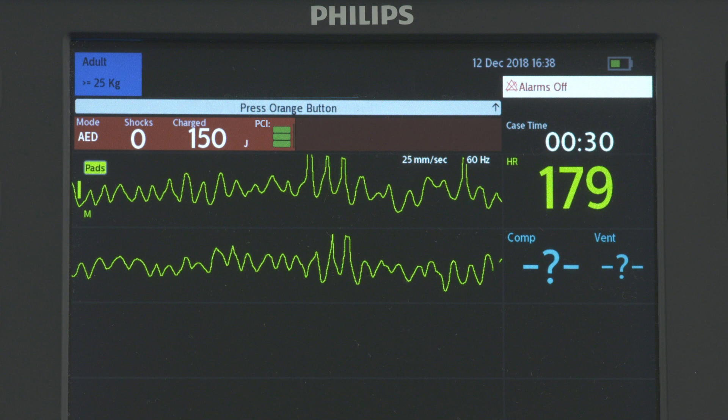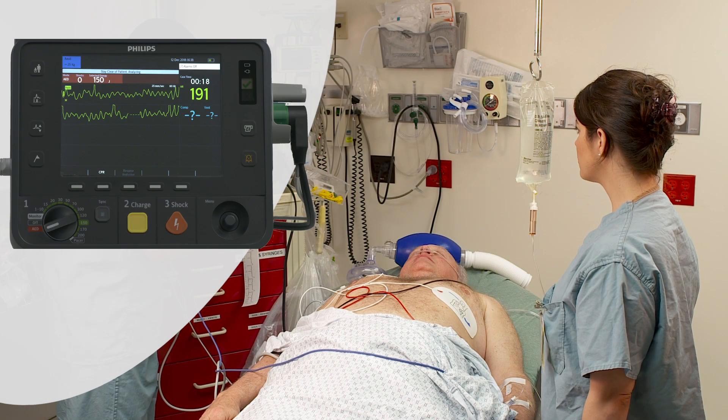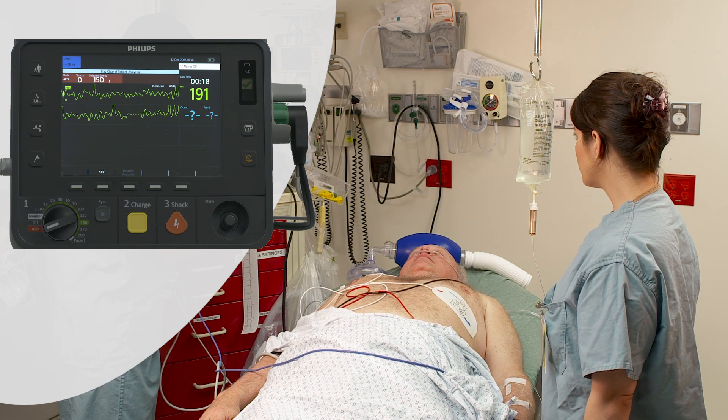Once charging is complete, the HeartStart Intrepid prompts you with "Shock Advised — Deliver Shock Now." Make sure no one is touching the patient or anything connected to the patient.